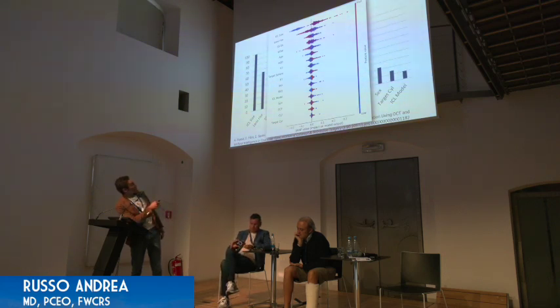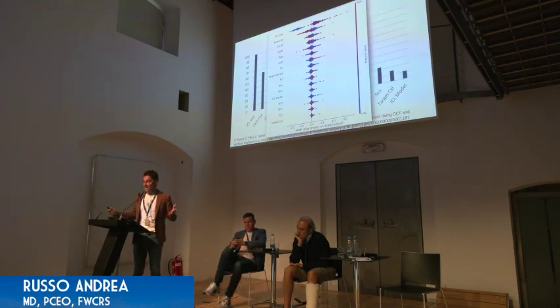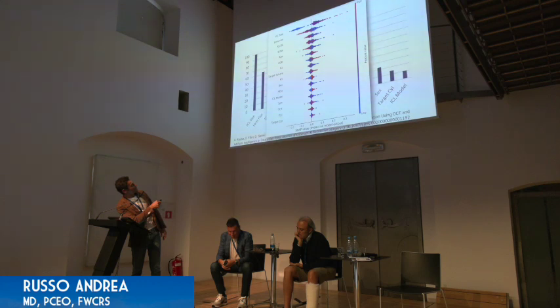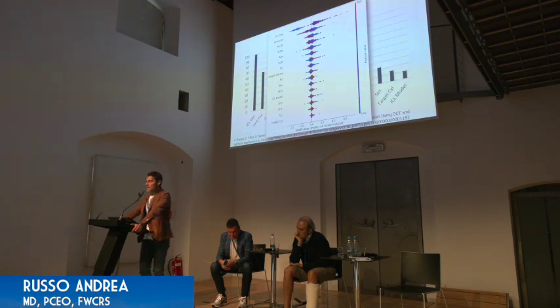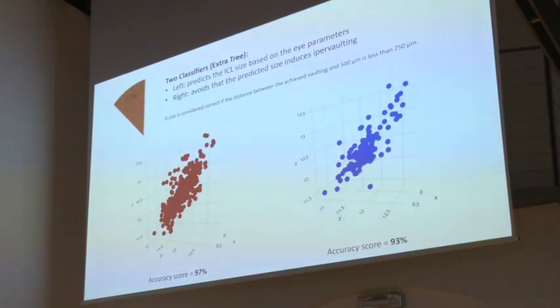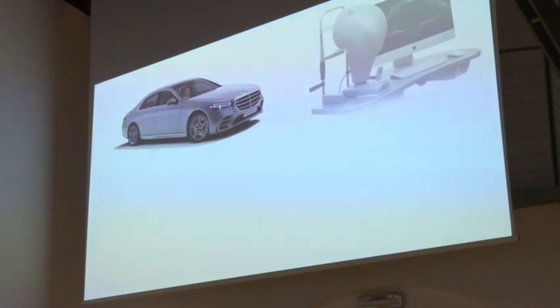The second most important parameter is what Eric said, lens rise, which is missing in the OCOS formula. And then all the rest: the distance between the scleral spur, the white-to-white, the ACD, the age, and all the rest. So pay attention to the details, and newer formulas take into consideration many more parameters. And I believe this will be the best solution.